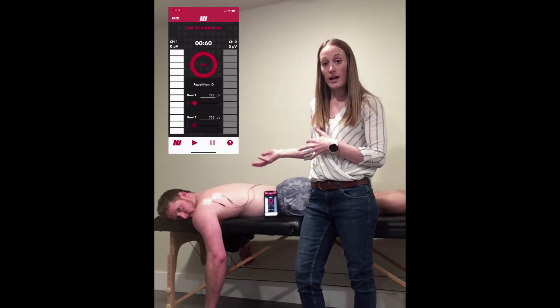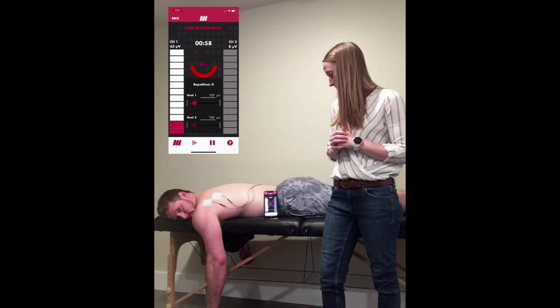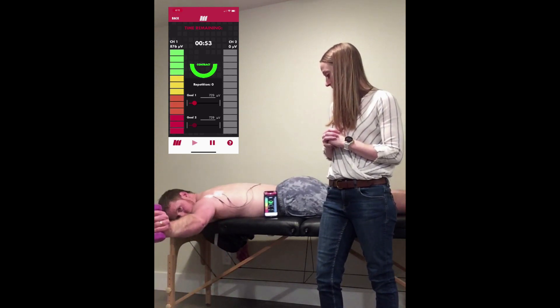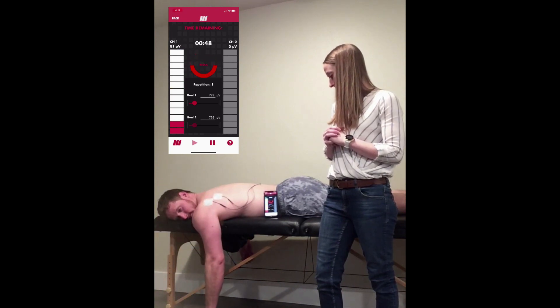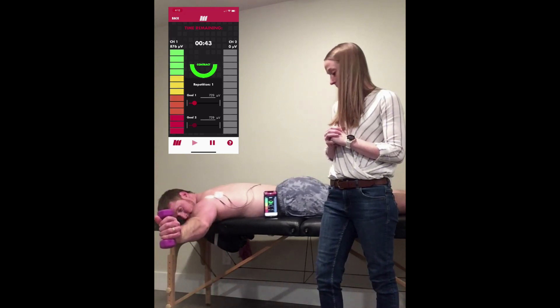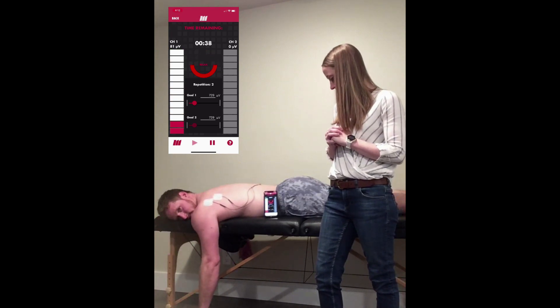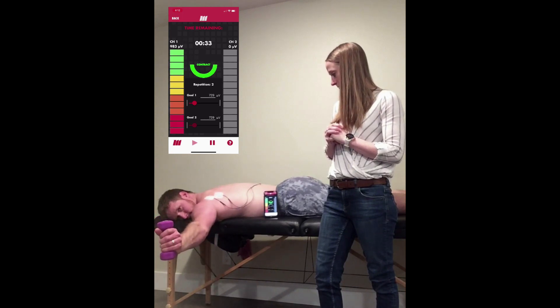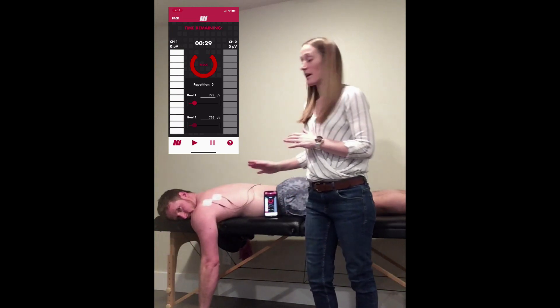I'm going to push play and he's going to demonstrate what this looks like. Good, and rest.